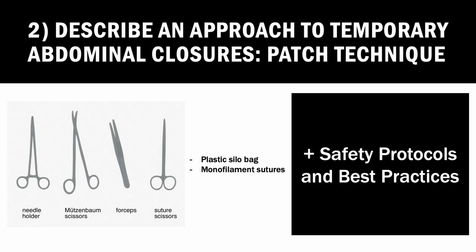You will need Metzenbaum scissors, a plastic silo bag, needle holders, forceps, monofilament sutures, and suture scissors. Remember to follow all safety protocols and best practices.